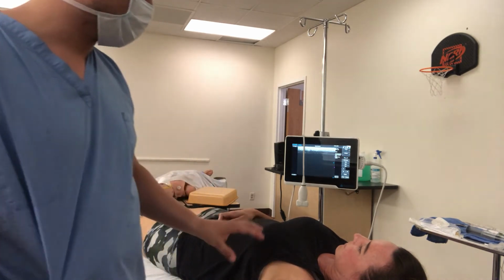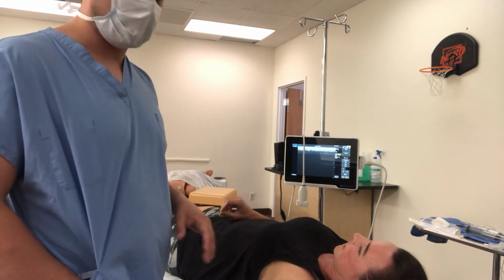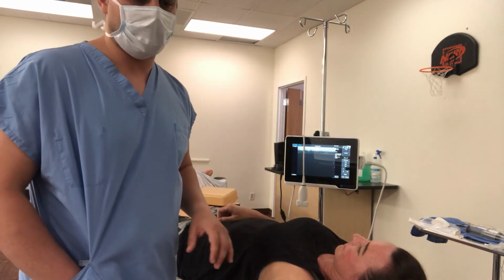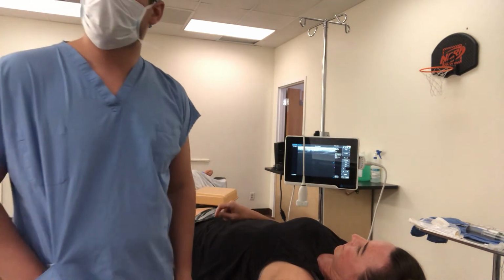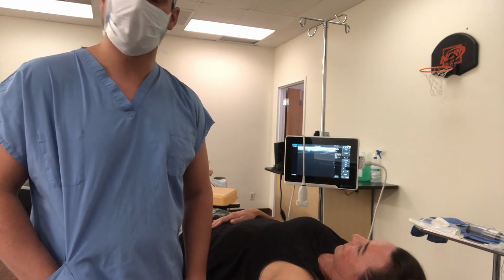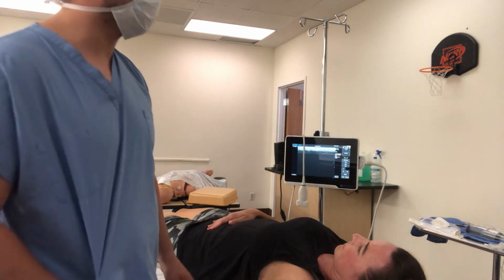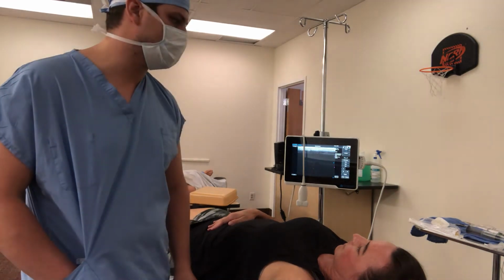Before I do the ultrasound, we will locate the axillary artery as well as the radial nerve, the median nerve, and the ulnar and musculocutaneous nerve. The patient understands the risks, benefits, alternatives, and contraindications to the procedure and has signed consent. We're going to give her some IV sedation. I'm going to put her on a monitor, blood pressure cuff, telemetry, pulse ox. I'm going to grab my ultrasound as well as my peripheral nerve stimulator.